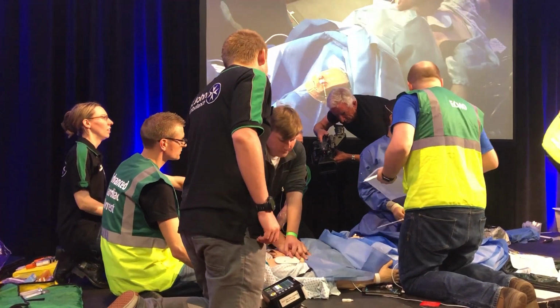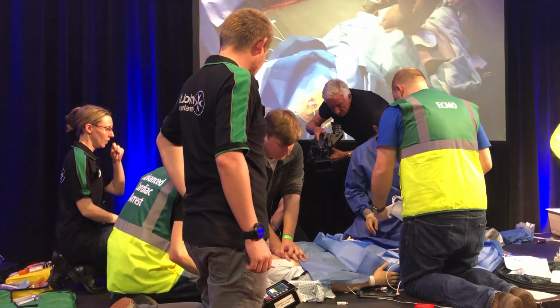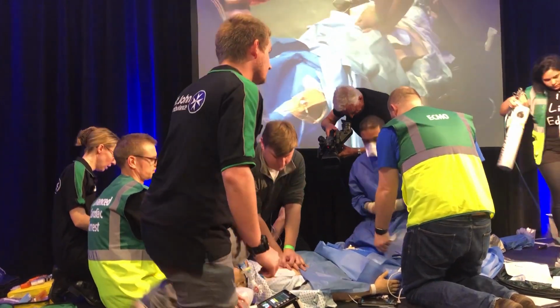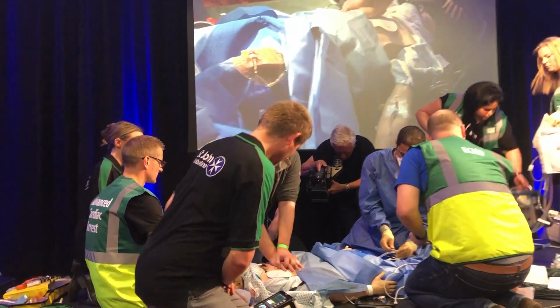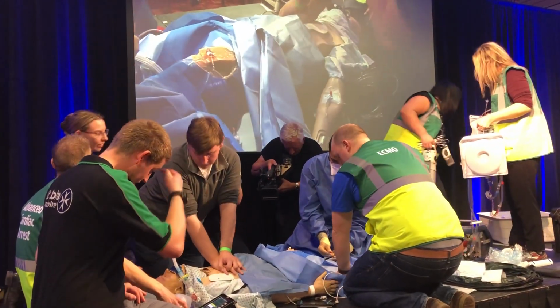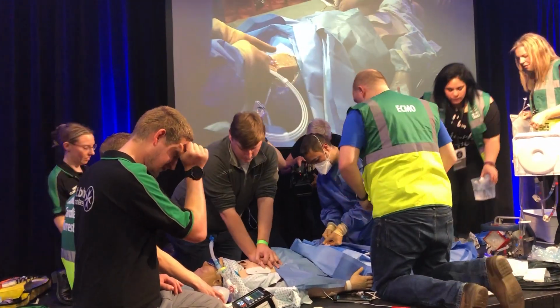Okay, Simon, we have control of both vessels. So, what stage do you have them in? Once they've got control of both vessels, they're going to put long wires in. So they've got one wire in the femoral vein and one in the femoral artery. We need to know where they are, so we do a kind of process of elimination.